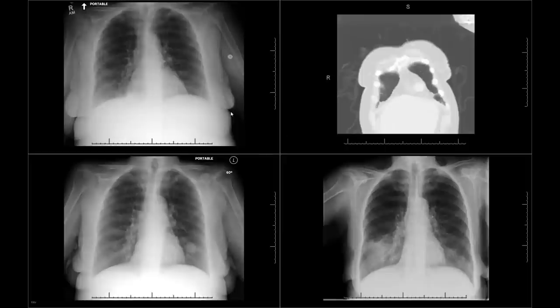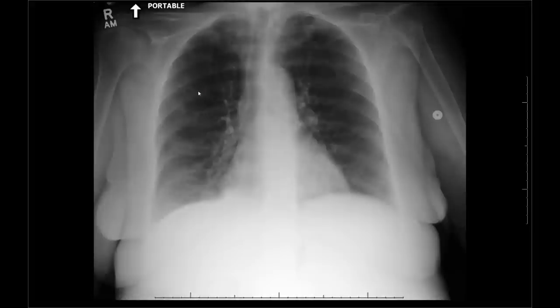Today I'm going to show you what is an x-ray of the chest. For example, this patient is an 87-year-old lady that has a normal chest radiograph.